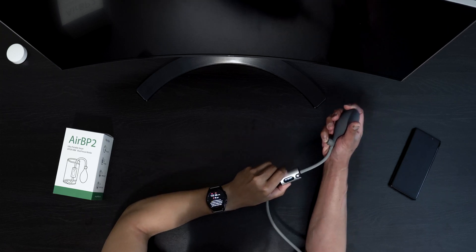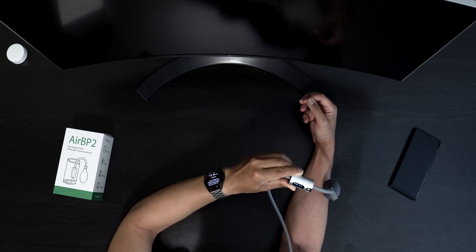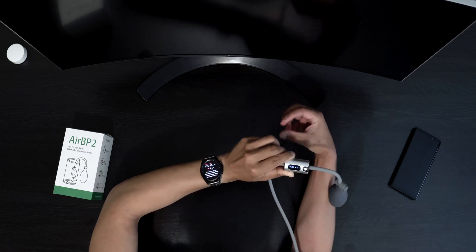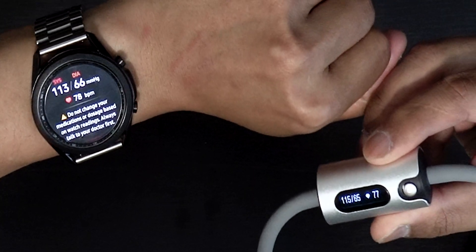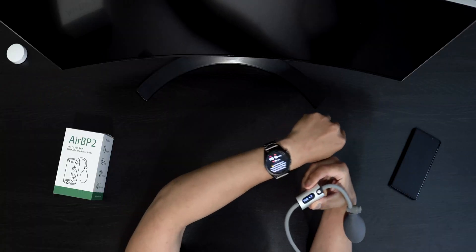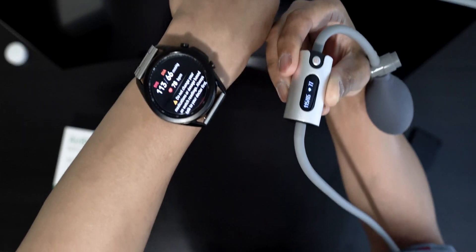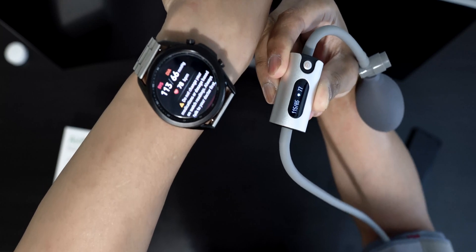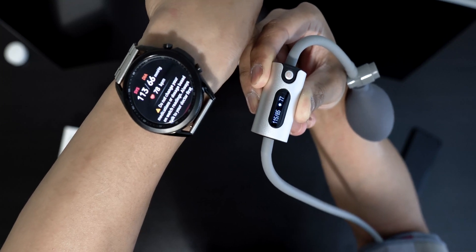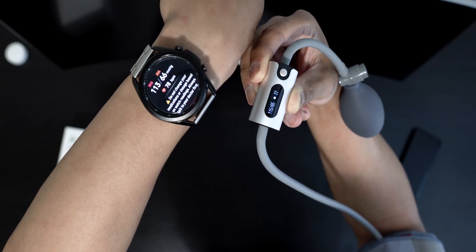Here's the first reading. On the cuff we have 115 over 65 with a pulse of 77. On the Watch 3 we have 113 over 66 with a heart rate of 78. Not too bad at all — very, very close. I'll put the camera closer so you guys can really see. We'll do maybe two more just to see the accuracy between the two.